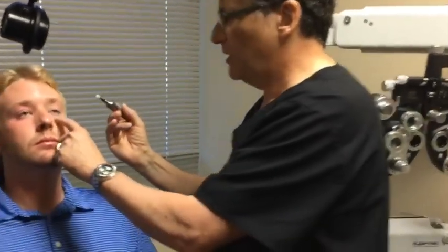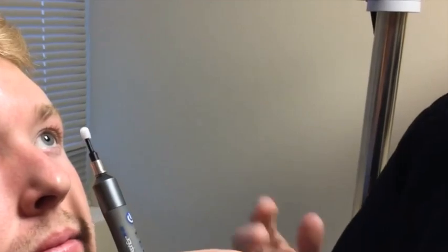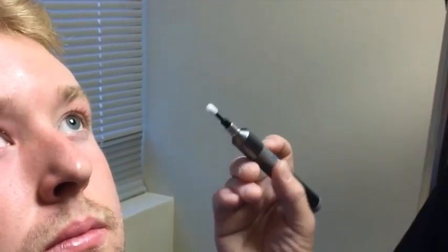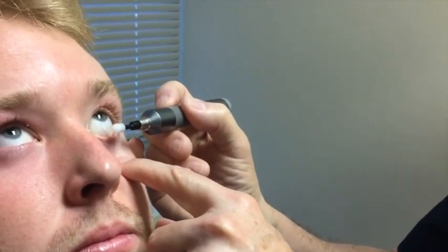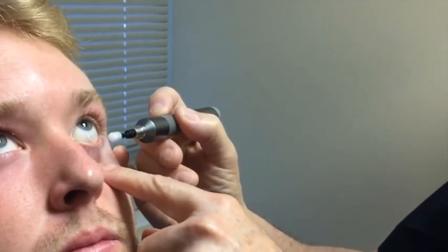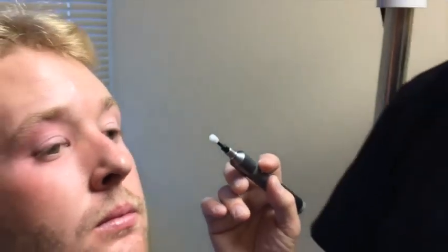Here's what happens. You can't get perpendicular to the lid margin, and this is important. You always want to stay parallel to the nose, perpendicular to the lid margin, whichever eye you're doing. If I'm right-handed and I try to treat the left eye, I end up coming in like this, and we don't want to be spinning into or away from the eye. The lashes don't clean well that way. You want to be in the horizontal, spinning in the horizontal plane like this. So I'm going to stand over there and show you how we treat the opposite eye.